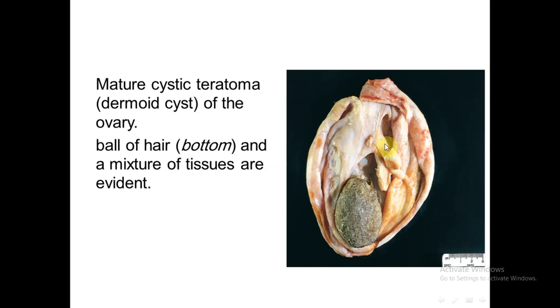Here is the gross feature of mature cystic teratoma, also known as dermoid cyst. The word dermoid comes from the most common component of this cyst, which are the components of ectodermal origin, including skin and neural tissue.